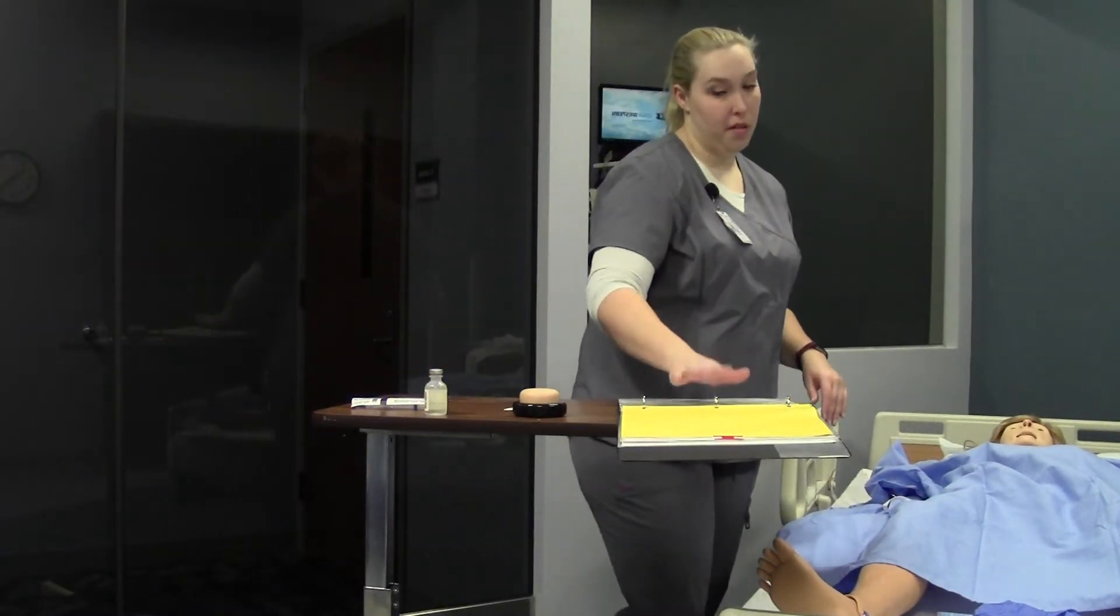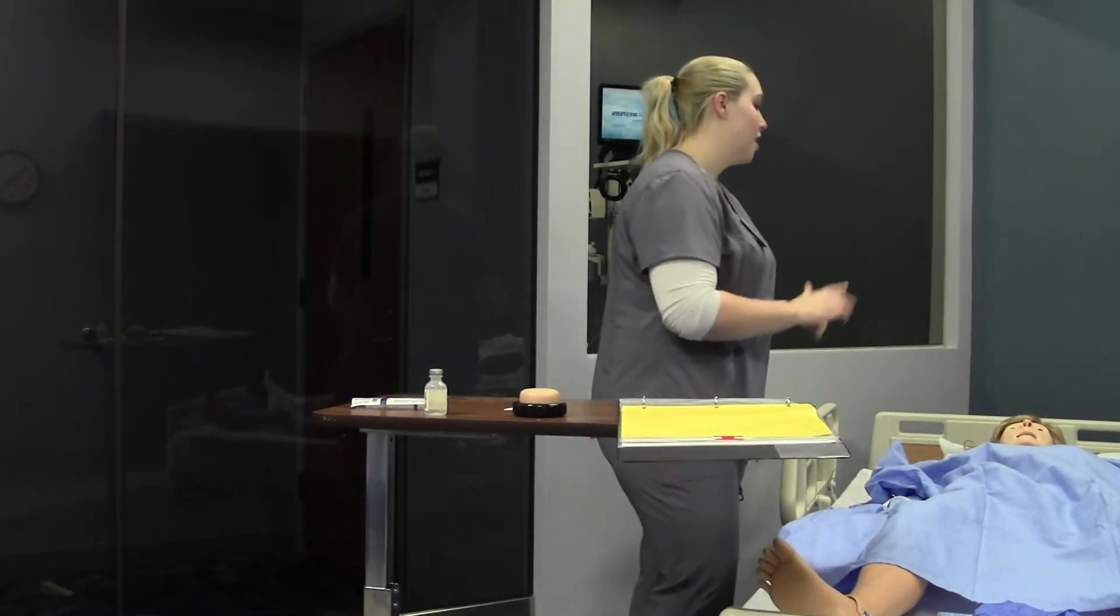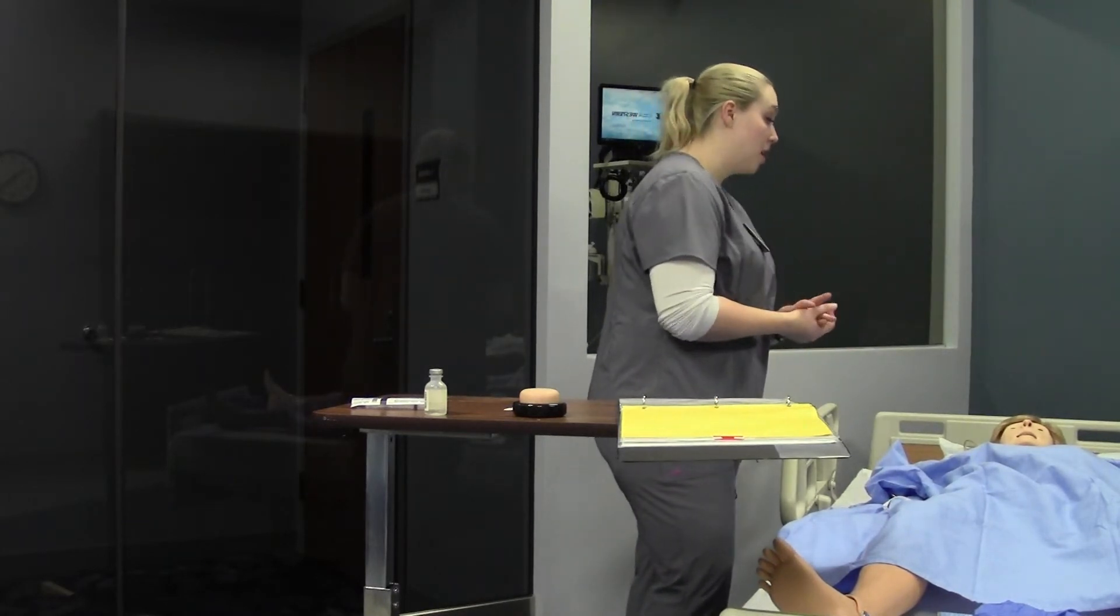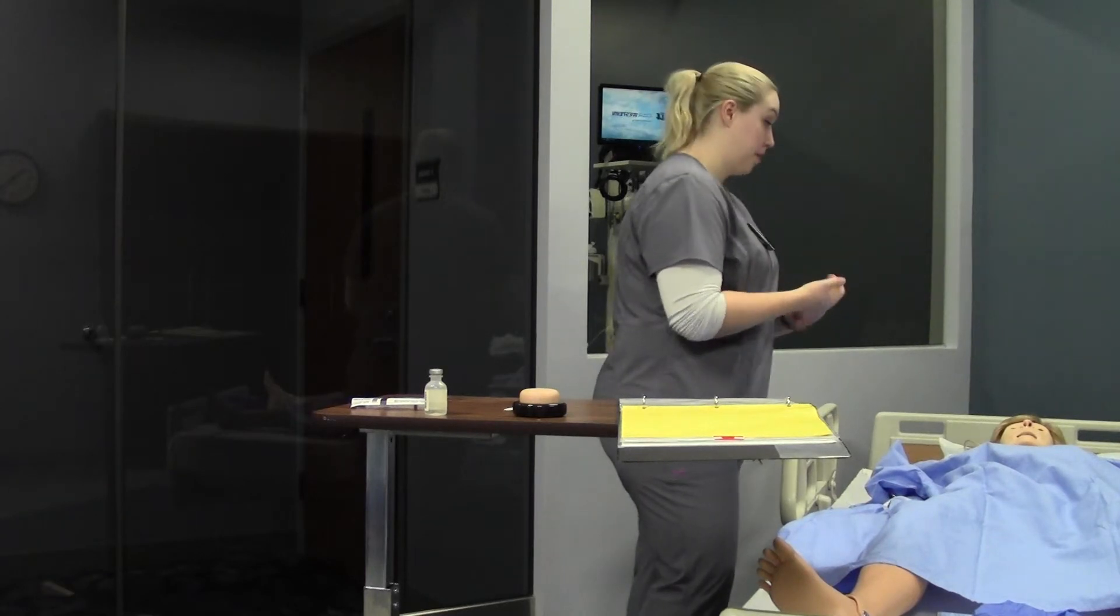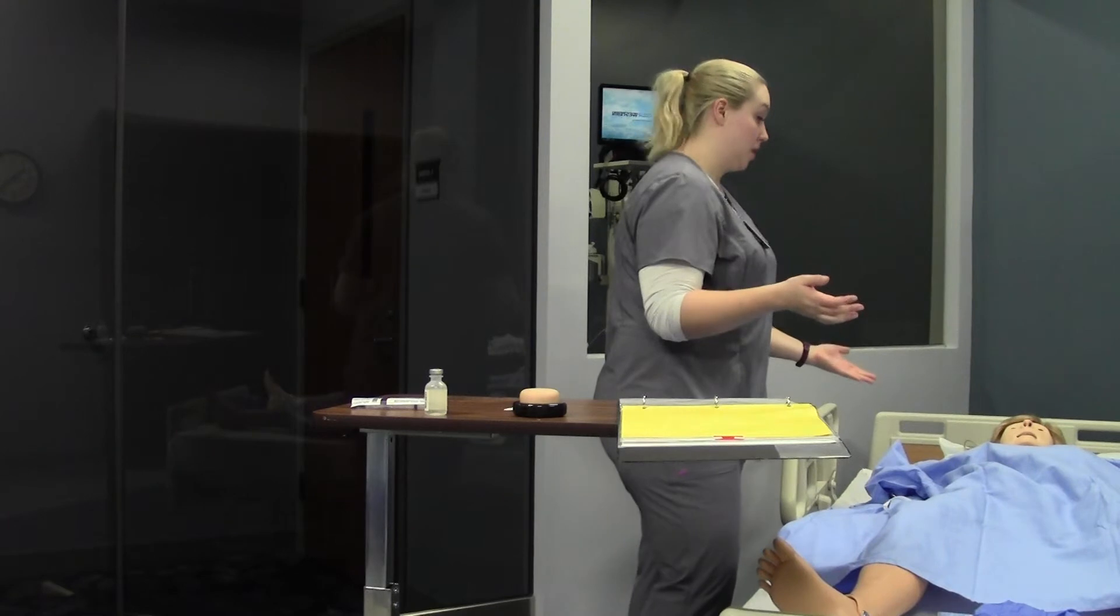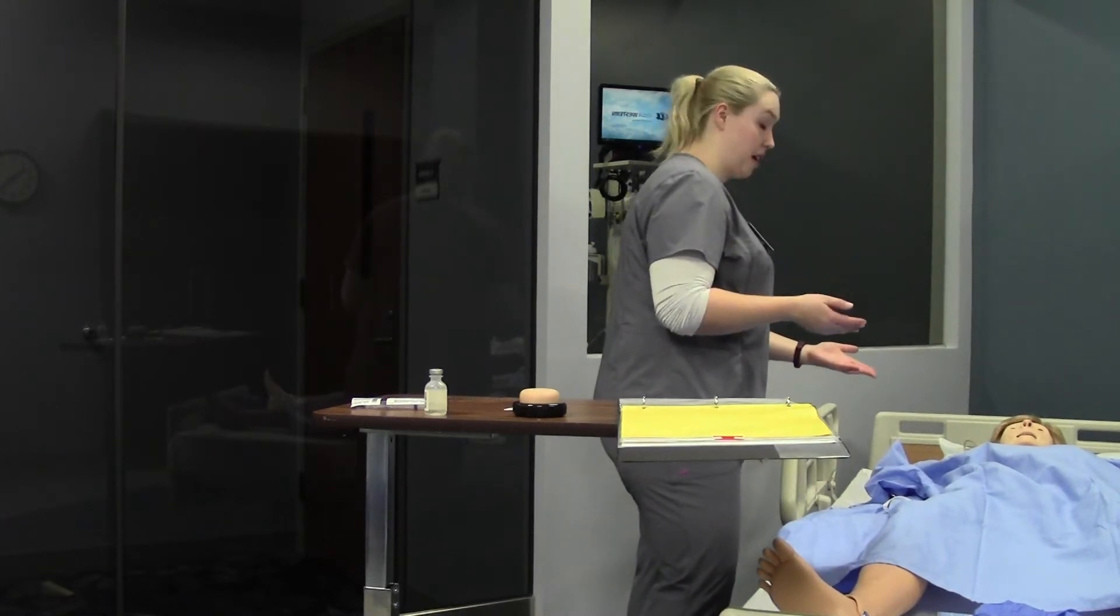I'm going to take my chart with me to check my patient and perform ADIT. Mr. Smith, my name is Erin. I'm going to be a student nurse today. We're going to be giving you your heparin, which is a sub-Q injection. Heparin is just a low-dose blood thinner that helps prevent blood clots while you're in the hospital with us.